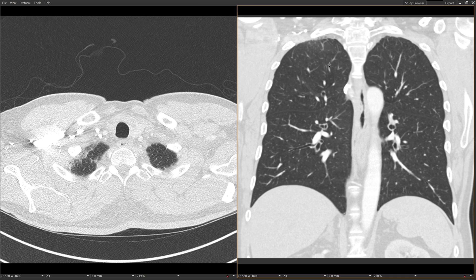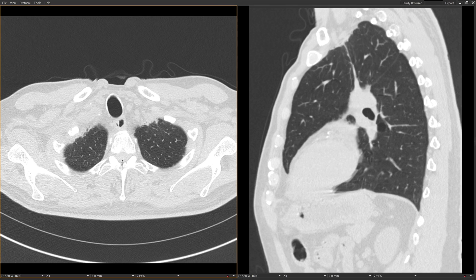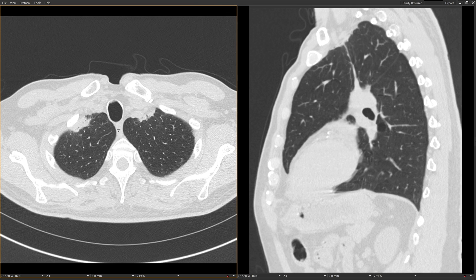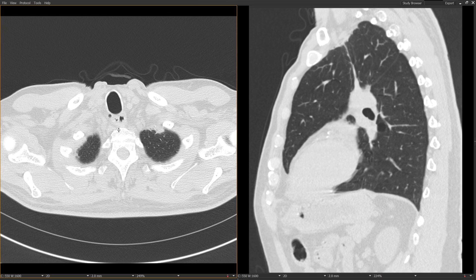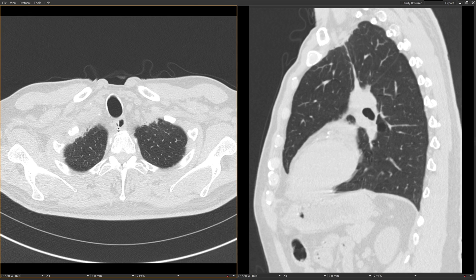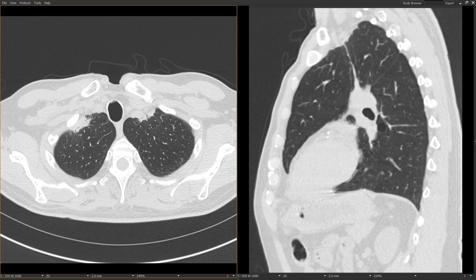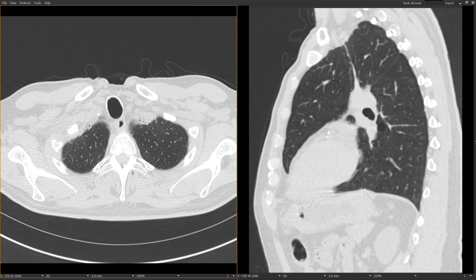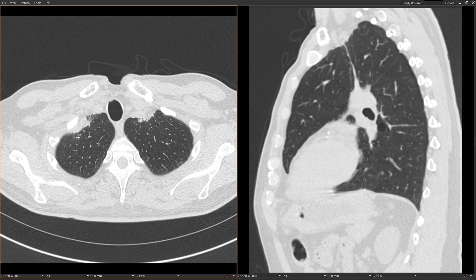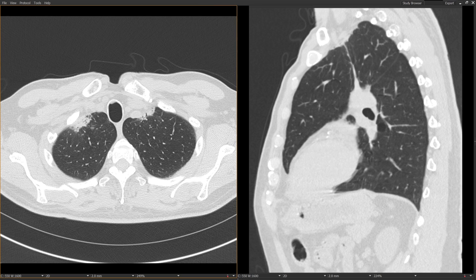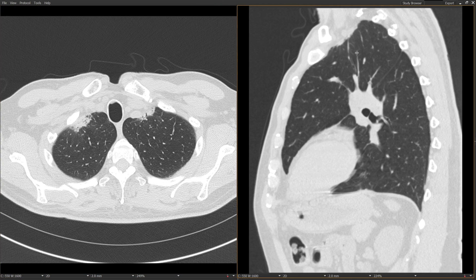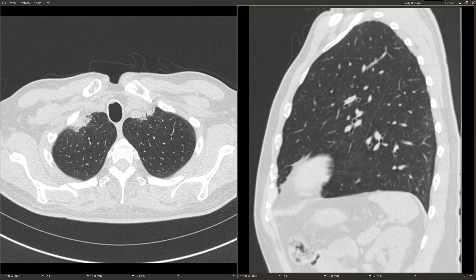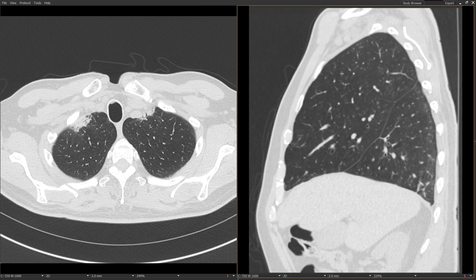I'll show you one other patient — someone who had right tonsillar cancer and received radiation therapy to the right tonsil as well as to the bilateral neck. This case is a little more conspicuous than the radiation fibrosis I just showed you. You can see it has the same appearance: fibrosis confined to the anterior part of the apices with that characteristic traction bronchiectasis. On the sagittal images, you can again see that typical plaque-like appearance seen in patients who've received radiation therapy to the neck.